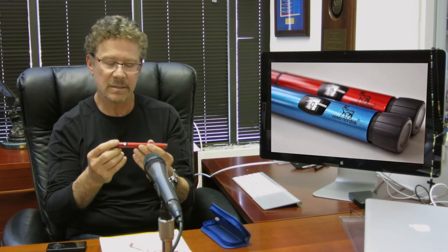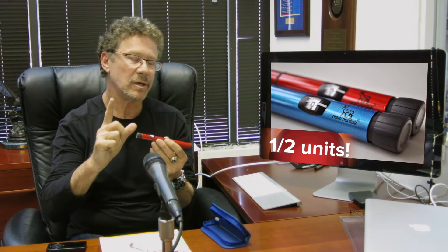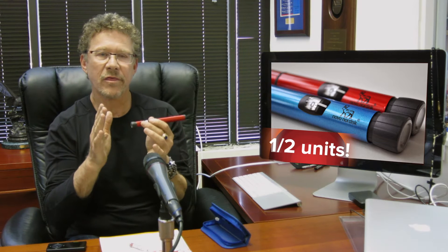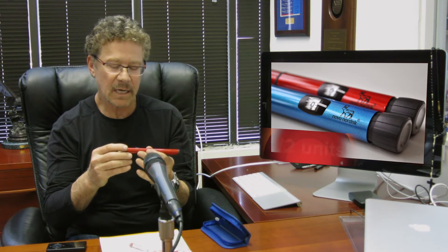The second feature is it gives half unit increments, not just one unit increments. For pediatric and young folks out there with type 1, or very insulin sensitive folks with type 1 diabetes, it can be quite helpful. So you can give yourself half a unit.